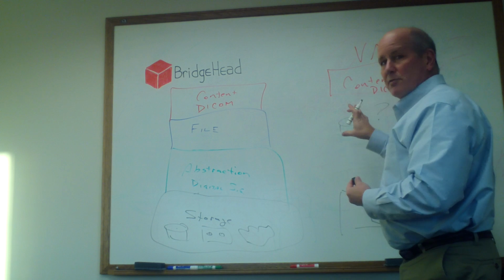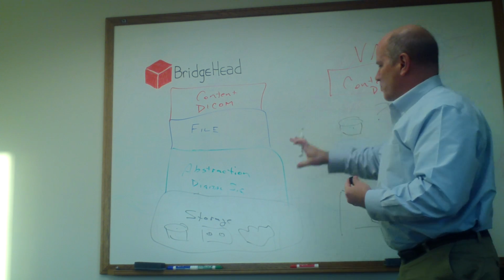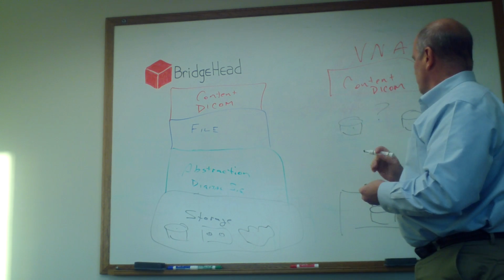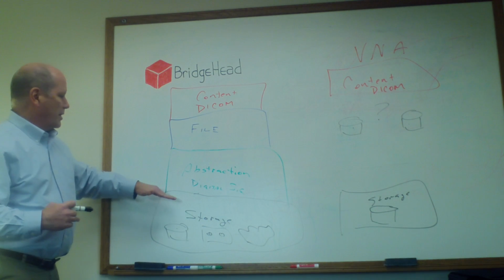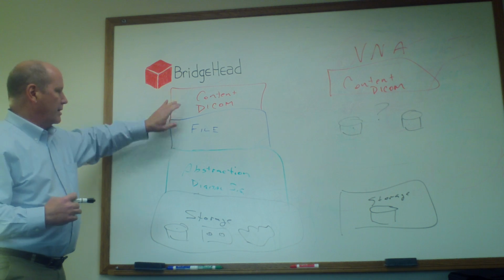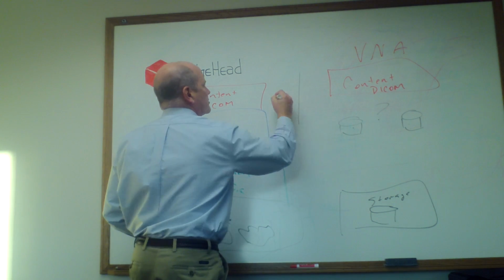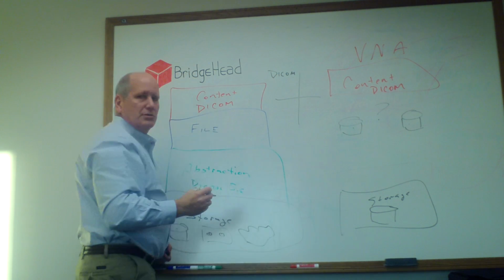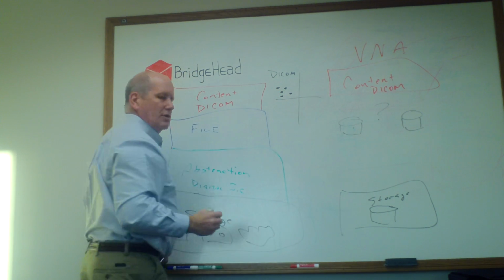They either have to get it from another company or they have to build it into the content layer. Building it upon the 4 layers, you get all of that functionality together. So with this platform, you get the ability to provide the content archiving built upon the file and protection layers. If you take a look at it from a graph perspective, you've got vendors that know how to do DICOM archiving. And there's many vendors out there that can do this, and they do a good job.